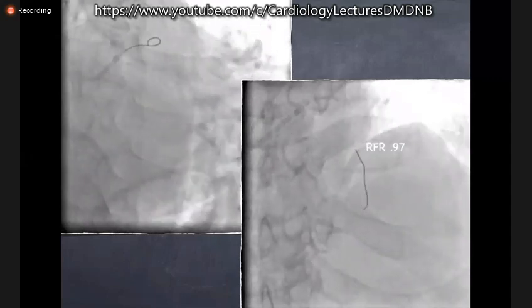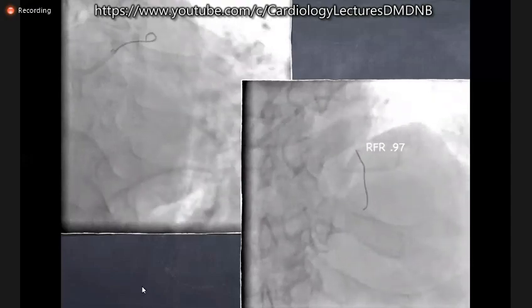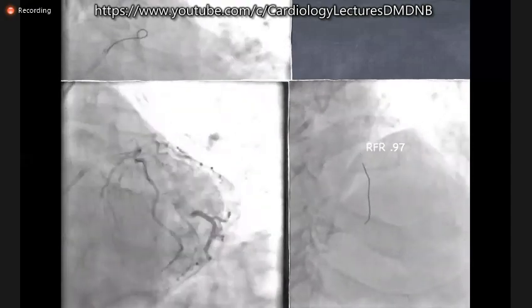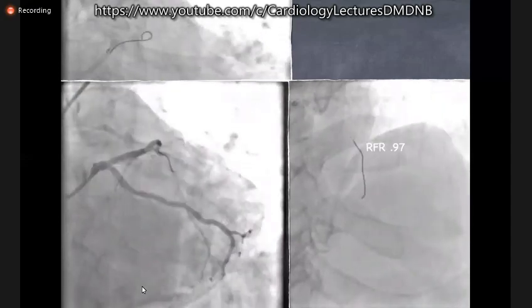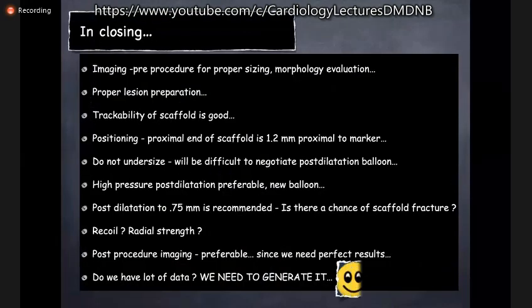I also did an RFR, which was good. Getting the RFR wire in was a bit difficult, but we managed to get it distally, and the RFR was good. So we stopped the procedure. The final result was good. The flow was good. My learning point following this case is that when I find a fibrotic or calcific lesion, I should prepare the lesion very well before going in with the scaffold. The markers are well visible compared to the first generation scaffold. And in a fibrotic lesion, I was a bit worried about the radial strength and a little bit of recoil.